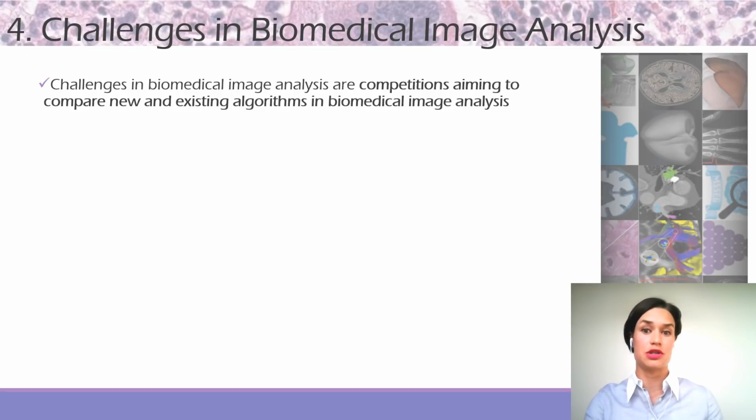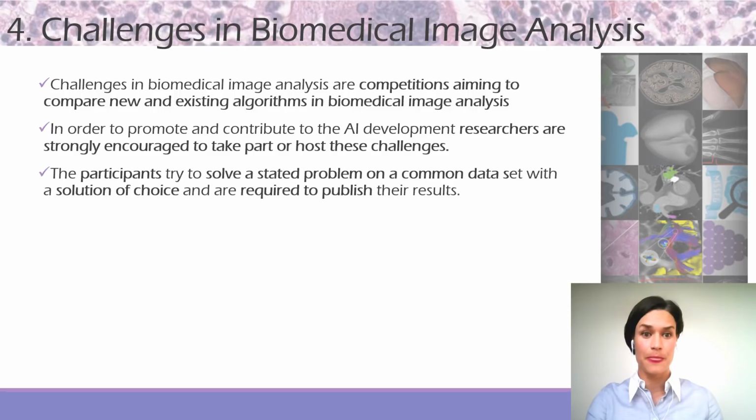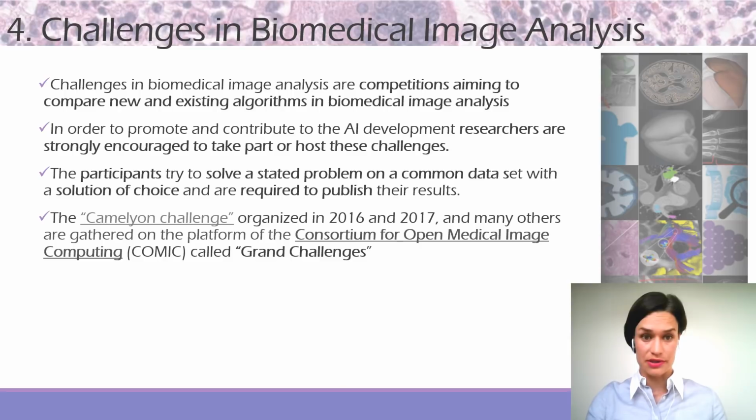These are competitions aiming to compare new and existing algorithms in biomedical image analysis. Researchers are very strongly encouraged to take part in those challenges in order to promote and contribute to AI development. The participants try to solve a stated problem on a common data set, and they can use a solution of choice and are required to publish their results.